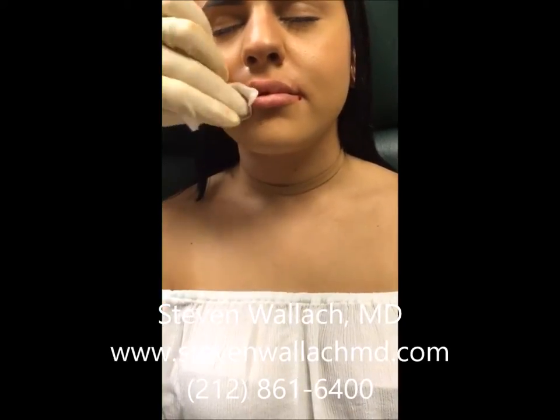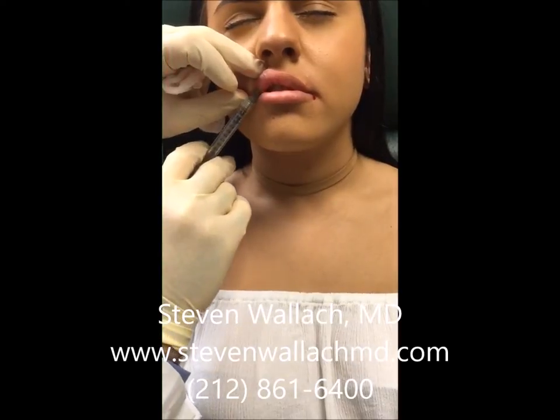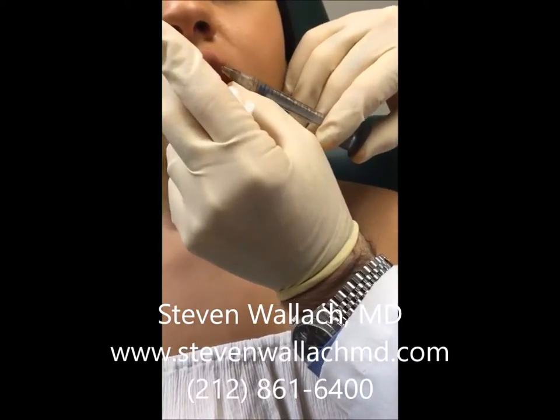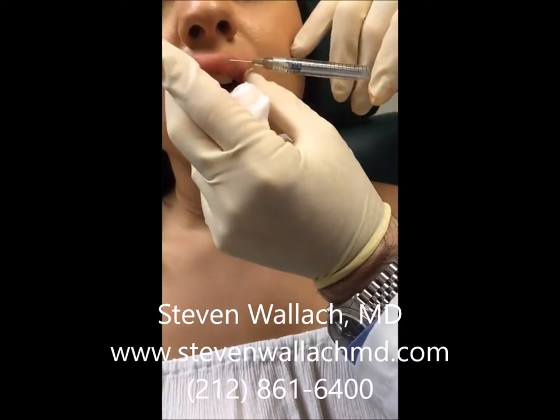Then depending on the patient preference, I use some of the material to inject the lip muscle, which I am doing right now. She felt that her upper lip was a little thin compared to her lower. Of course the lower lip is usually fuller, so I try to balance this out a little bit for the patient.